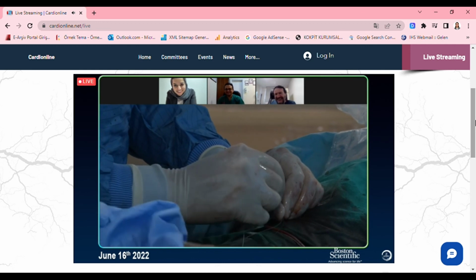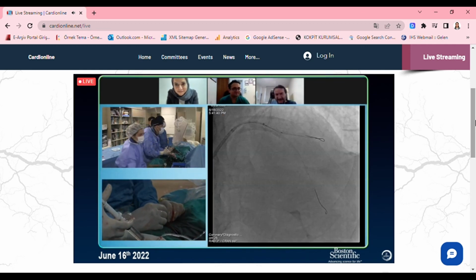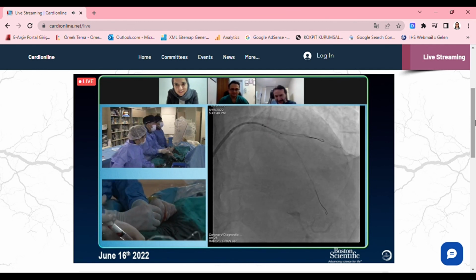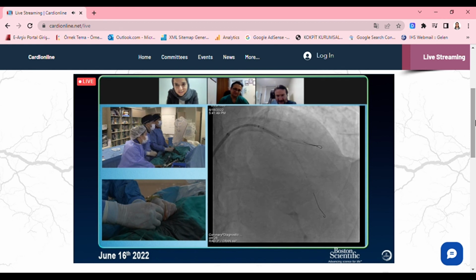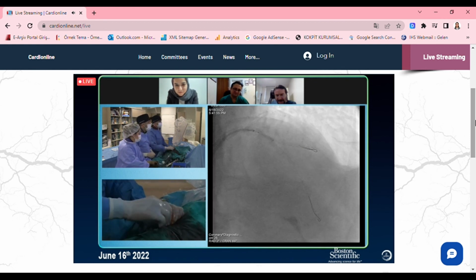All right. It's good here. I do, yeah, okay, go up 10, 14. 14. 20. But good opening. That's okay, opening is okay. Down.